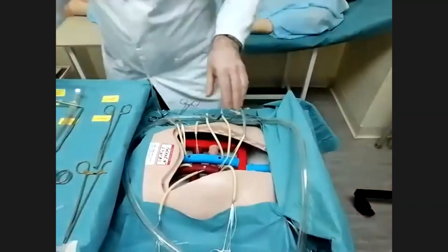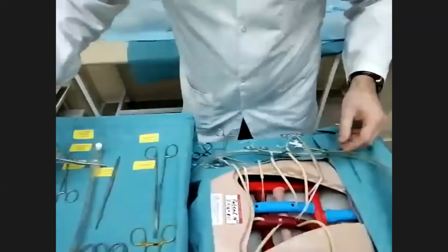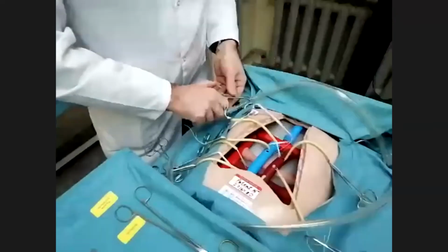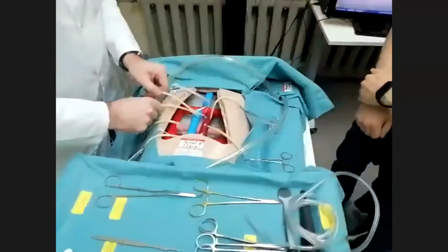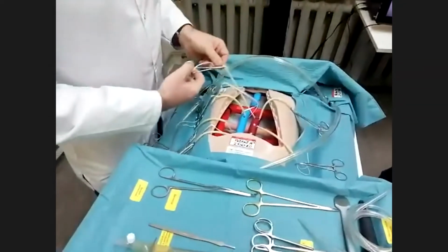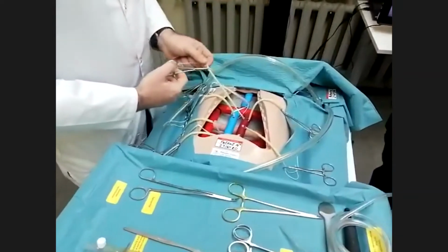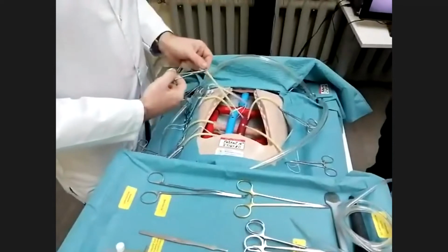Okay. First of all, I give the command to my anesthesiologist: please give heparin.